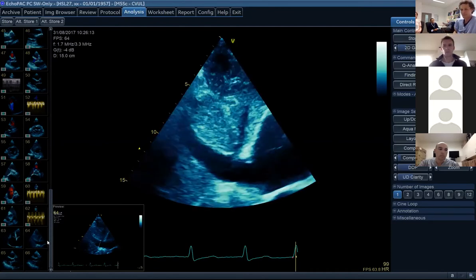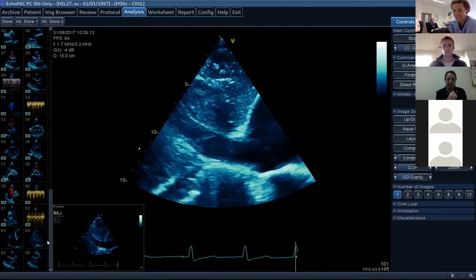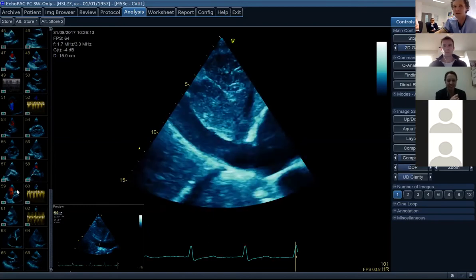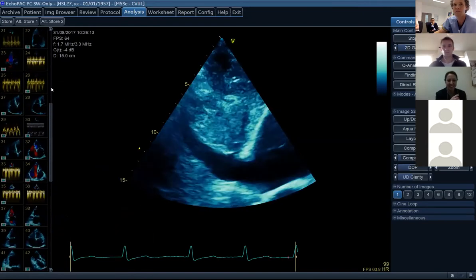Hope so. Sam, can I ask a question? It's Danielle here. Sorry, late as usual. Missed the start. Saw the big atria. Yes. What rhythm do you think she's in? I think she's in sinus rhythm. Consistently? That's a great question.